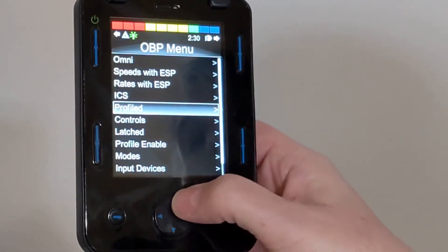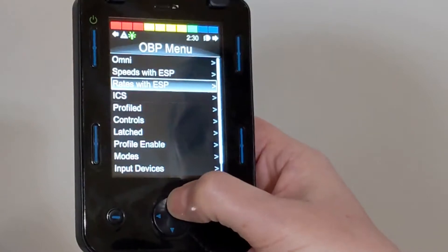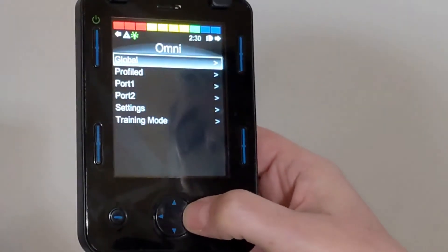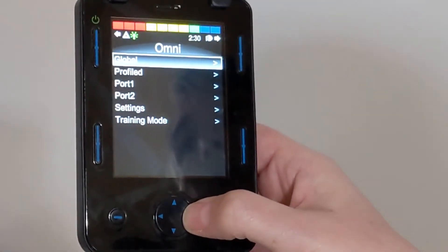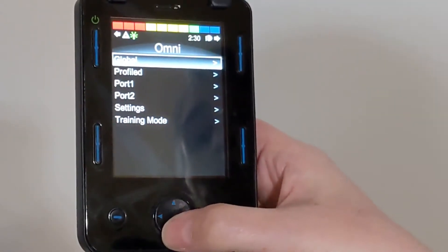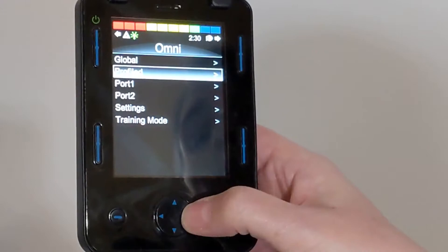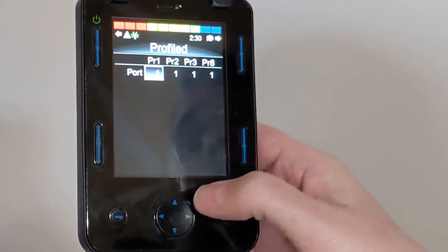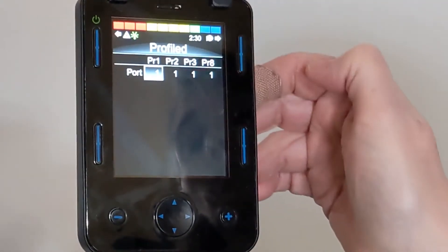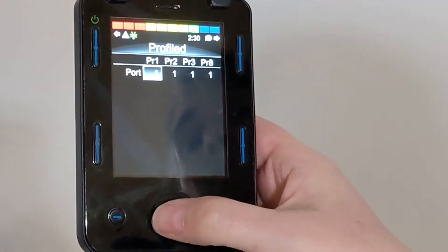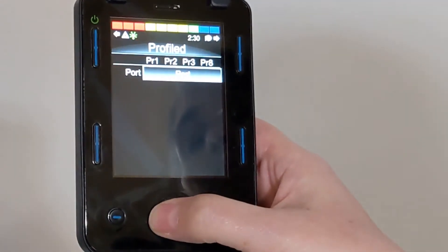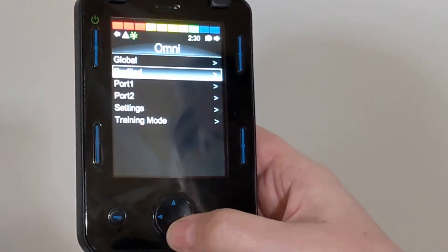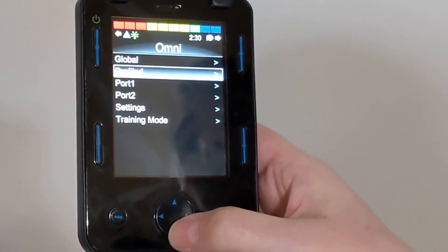Now we're going to go into Omni, and we're going to go to Profile, and Omni, and we're going to make sure this is all set to 1. Now we're going to go down.